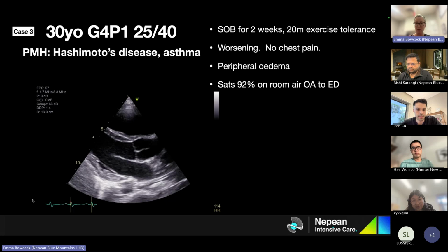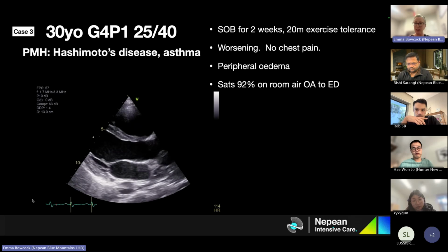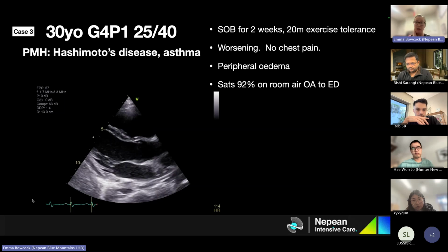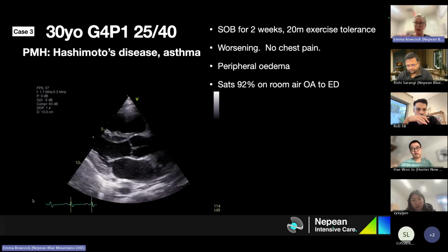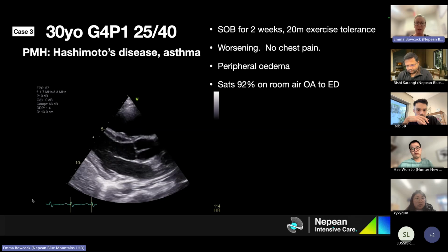Yeah, good job, Rob. I think with prompting, you would have got through that okay. I think it's just a case of seeing more bicuspid valves and knowing how they can look. And they all do look a little bit different because that was a true bicuspid. You might have different flow patterns where you've got right and left coronary fusion and all of that. So the flow profile with colour Doppler does look different in all of them.